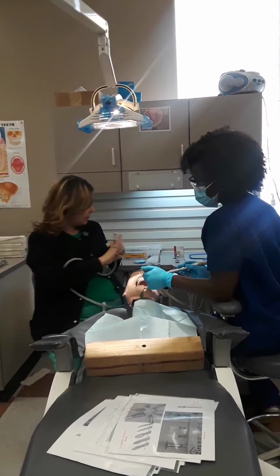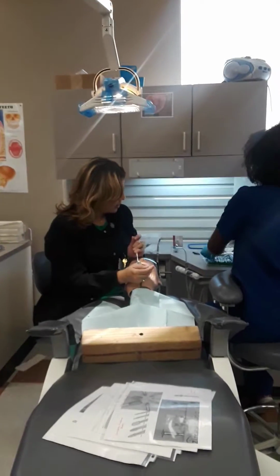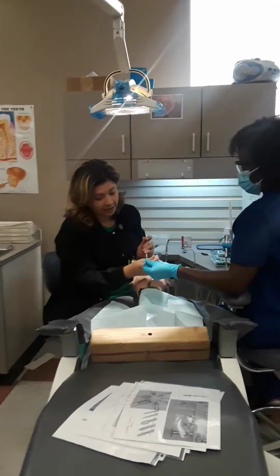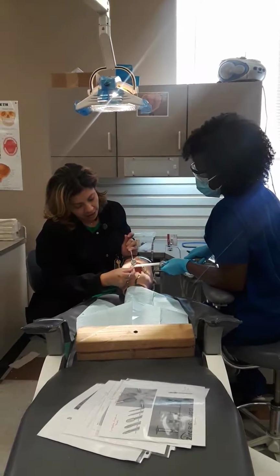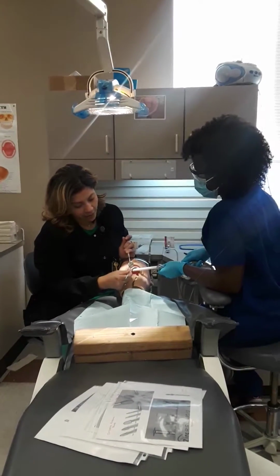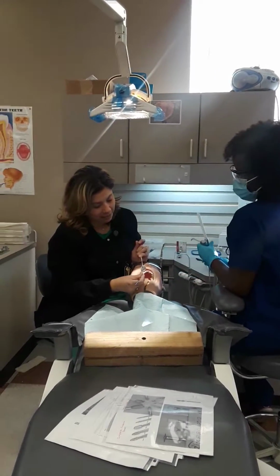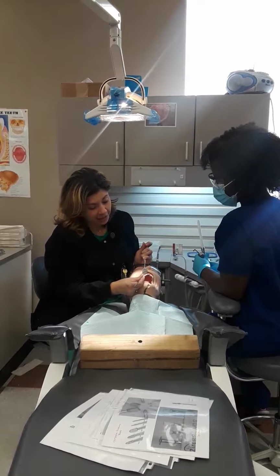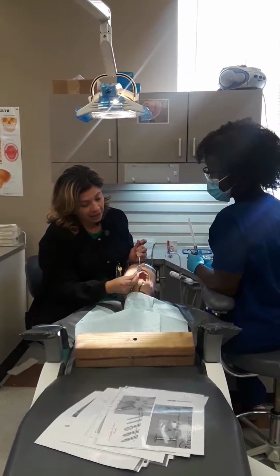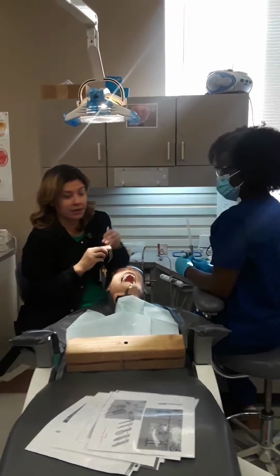Okay, after you finish, let's check again. So he'll just re-verify after we do any type of finishing. Oh yeah, it's smooth. So the reason for the explorer, we want to make sure it doesn't stop or catch like this. See where I'm having trouble? That's where it keeps catching. So here, see how my explorer just glides? That means we are great. So we are done actually with this filling.